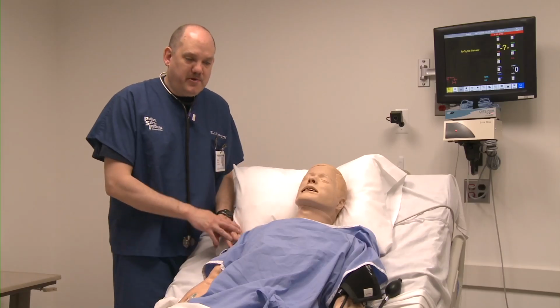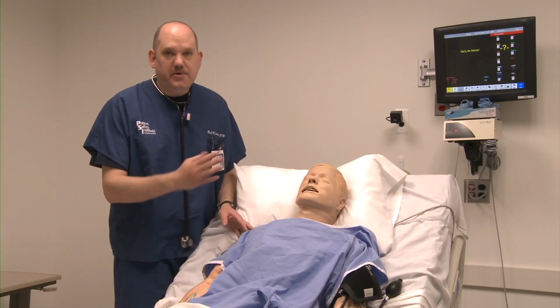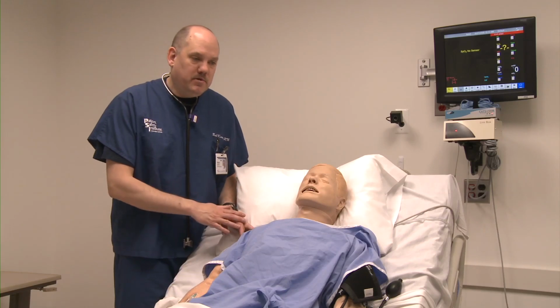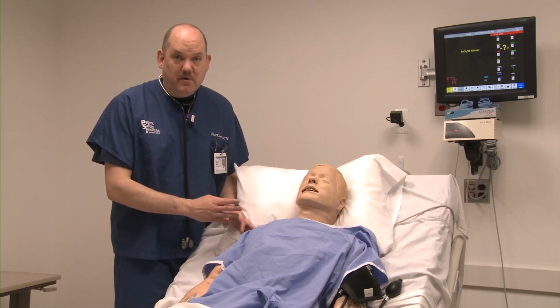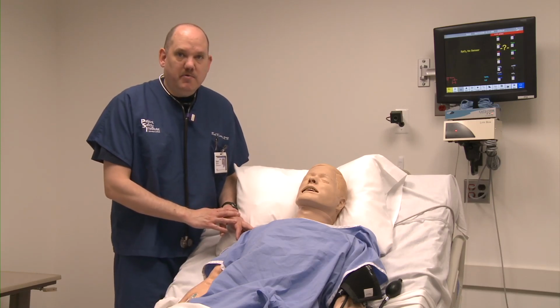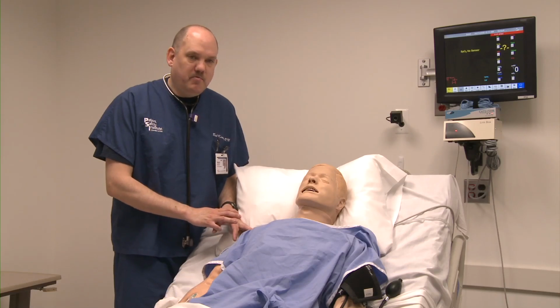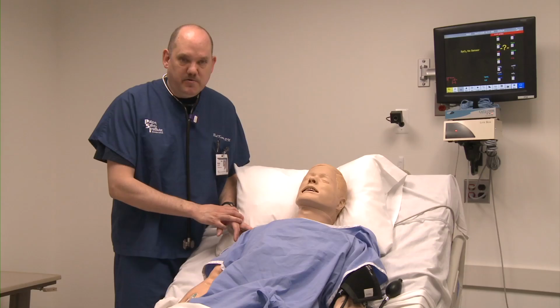There are no breath sounds in SimMan's back. Therefore, it is not necessary to sit the patient forward or roll him over to listen to the posterior thorax. However, that would be part of a routine physical examination, so when you come to the part of your assessment where you would perform that, please tell us that that is what you want to do.